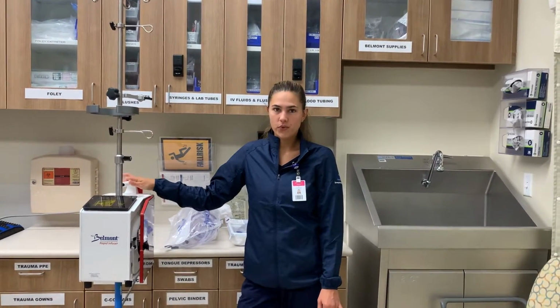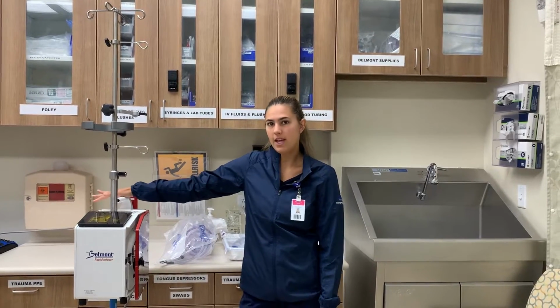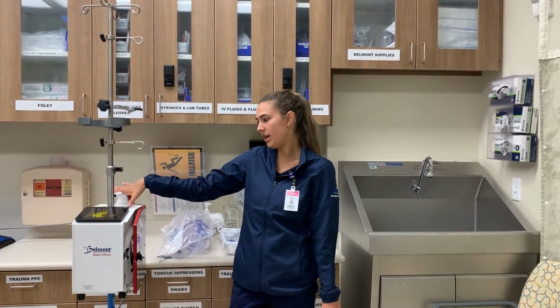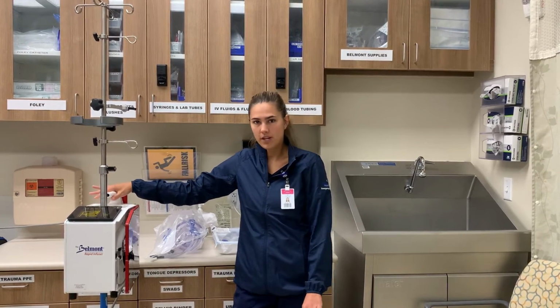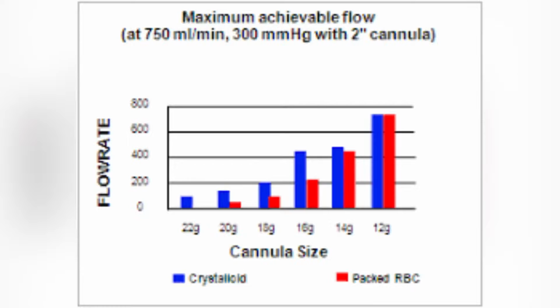The Belmont is very useful if you are trying to rapidly transfuse a patient. Our Belmont can rapidly transfuse up to 750 milliliters per minute. However, that is only if the patient has a large catheter. If you take a look at this chart, this shows you the maximum achievable flow rate for each size catheter. For example, if the patient has an 18 gauge catheter, the Belmont will infuse about 200 milliliters per minute of fluids and about 100 milliliters per minute of blood. If the patient has a central line that is 12 gauge or larger, the Belmont will infuse up to 750 milliliters per minute of both fluids and blood.